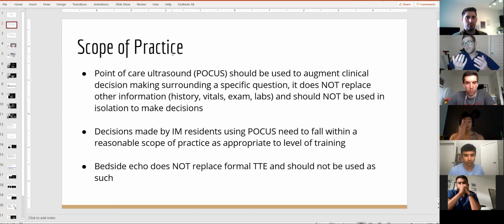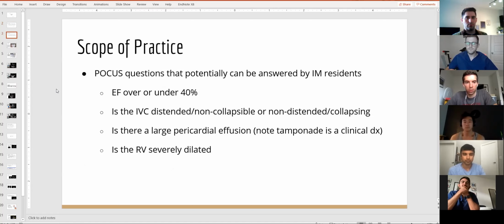So decisions by IM residents and all of us need to fall within a reasonable scope of practice for your level of training. And for us and for you guys, bedside echo doesn't replace a formal surface echo, and shouldn't really be used as such. So the questions that I think are appropriate to answer, statements that can be made based on POCUS, really are global function.